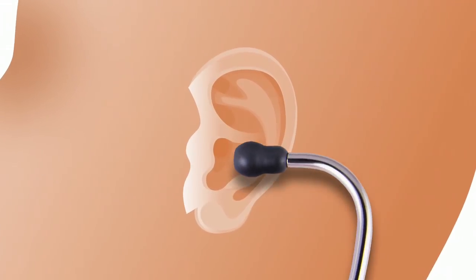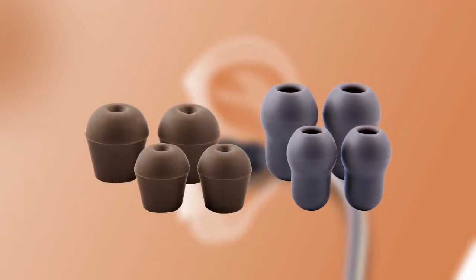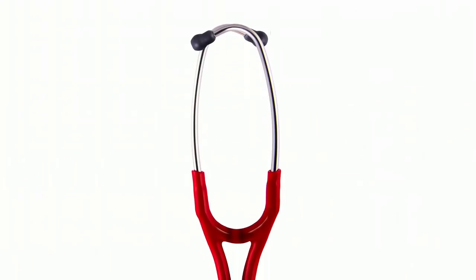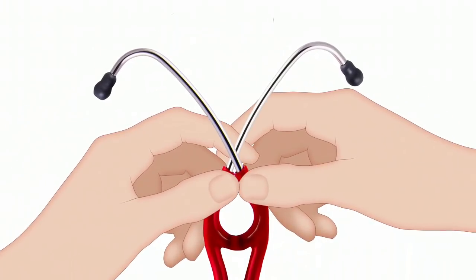When inserting the stethoscope ear tips into your ears, they should point forward. Littmann stethoscope ear tips come in both small and large sizes, as well as soft and hard, for an effective seal and comfortable fit. To adjust the tension of the headset, hold on to both ear tubes and either pull them apart or squeeze them together.